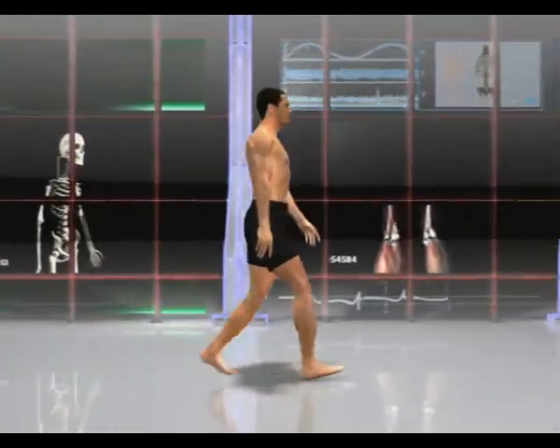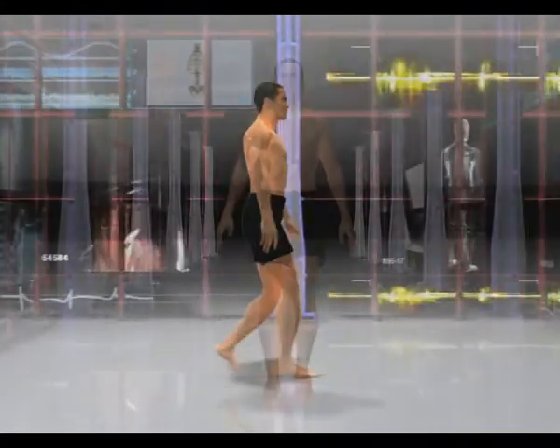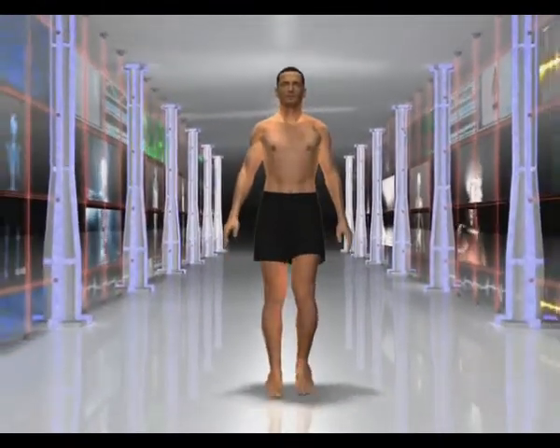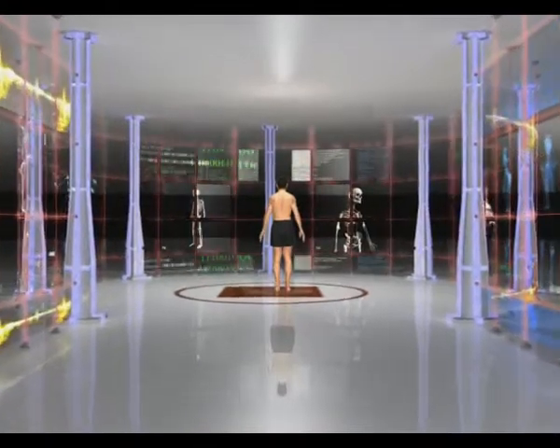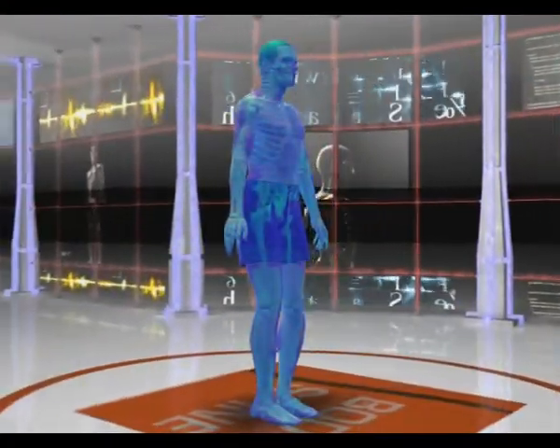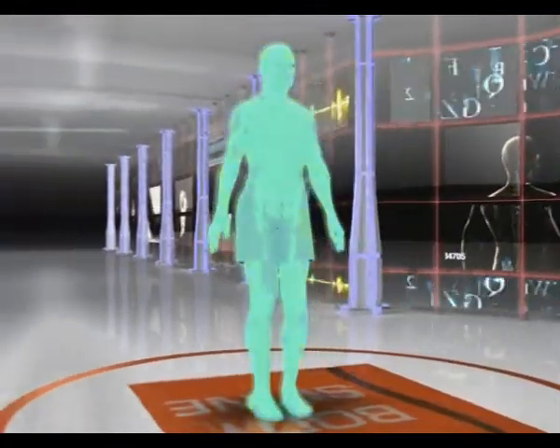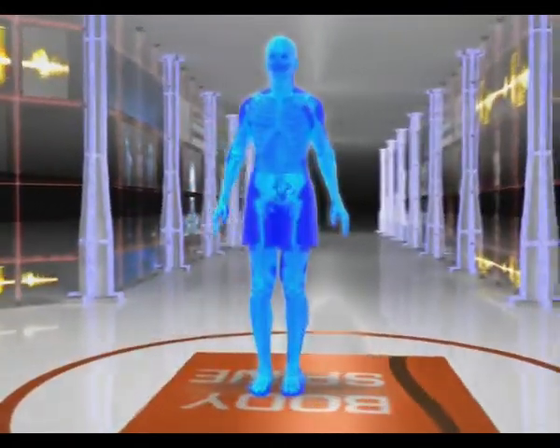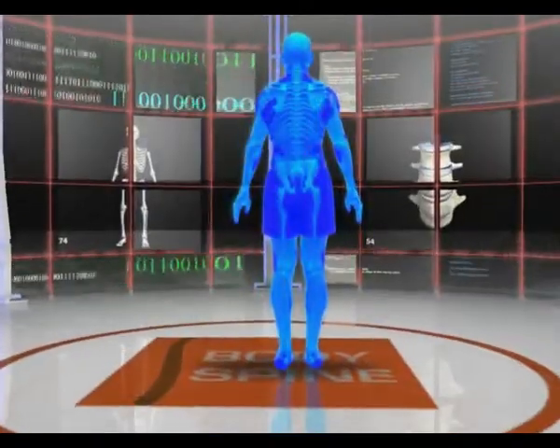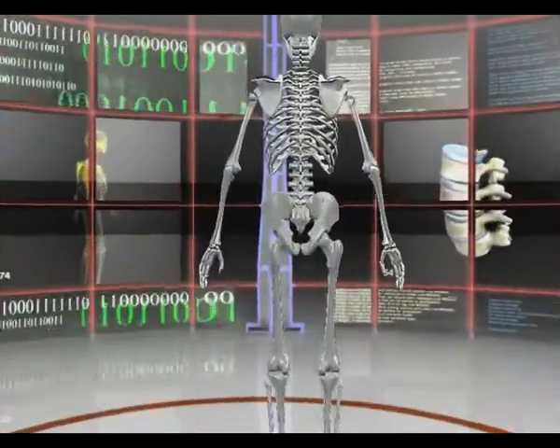The well-being of our spinal column has always been given great importance, as it can cause numerous extremely painful pathologies. For this reason, several studies have been carried out, demonstrating how a bad posture can be the main cause of osteoarticular system problems. 3D Bodyspine was born from a medical need of facing posture problems in general, and in particular secondary scoliosis paramorphism, without radiography, and to give the patient the possibility of having more frequent checkups.